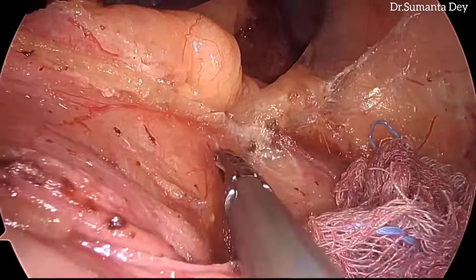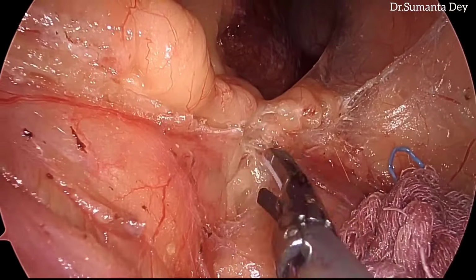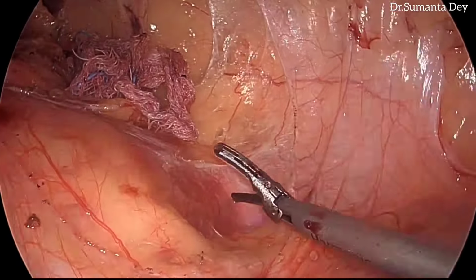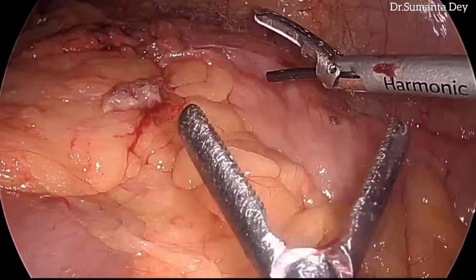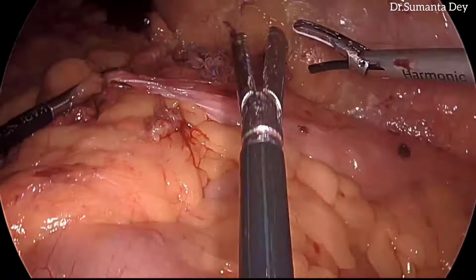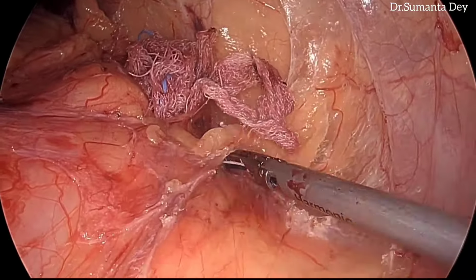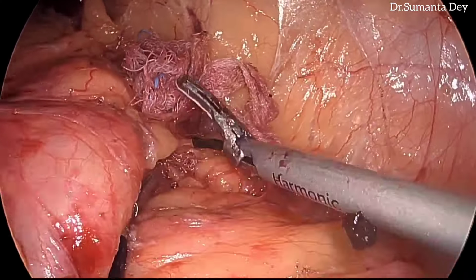So you can see I am going gradually towards the splenic flexure, and the lower pole of the spleen can be visualized, and the splenocolic attachments were divided using harmonic shears. The left colon is completely mobilized now, gradually getting mobilized after dividing the lateral attachments, because the medial to lateral dissection was already done.